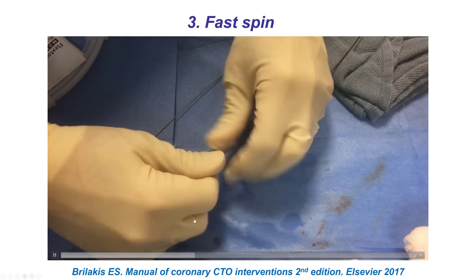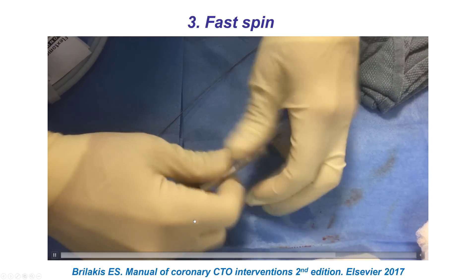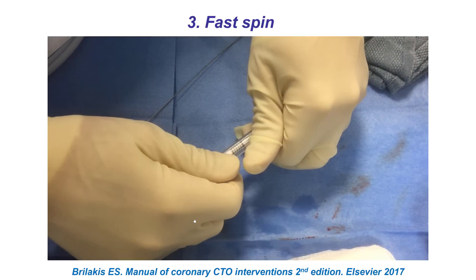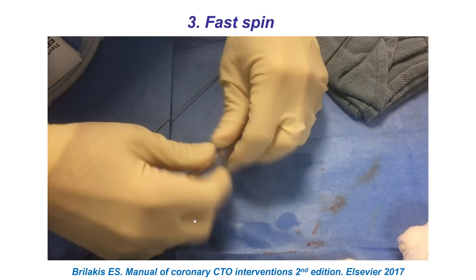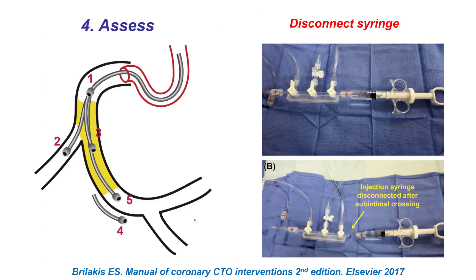The reason is that if the CrossBoss jumps, the torquing device provides a stop that does not allow the device to go very far distally, potentially causing a perforation. The next step is to spin the device very quickly — either direction is fine. The CrossBoss may do nothing for a few seconds and then all of a sudden jump and go into various locations, so the next step is to understand where the CrossBoss catheter has gone.